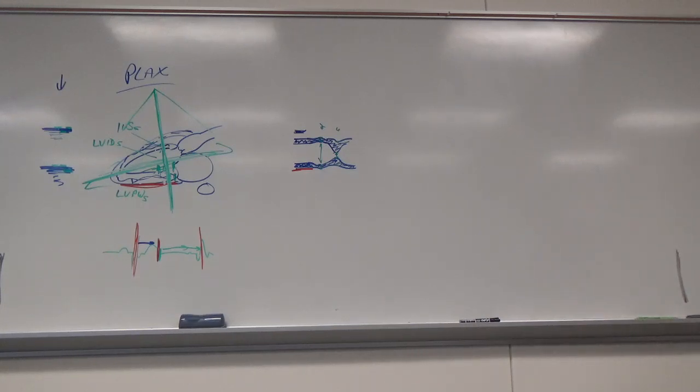And on the motion mode, it's still the top leading edge to the, on the bottom one, the top one as well? Yeah, so leading edge to leading edge for everything. It's pretty much right on when you're looking at the walls.